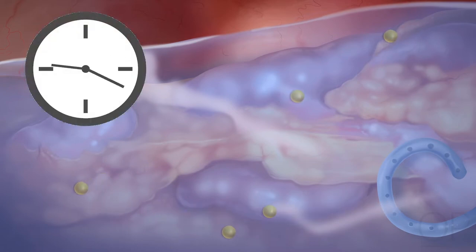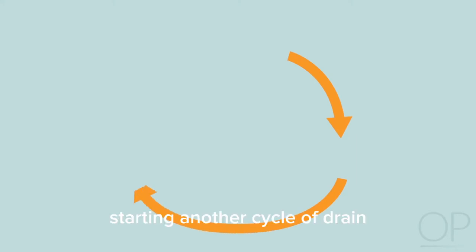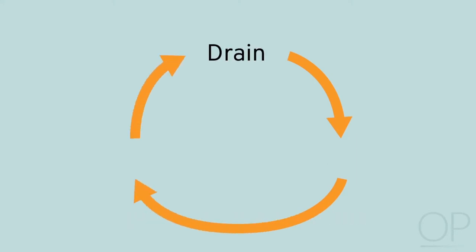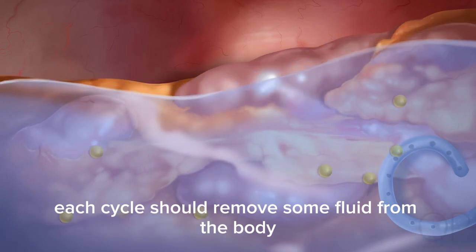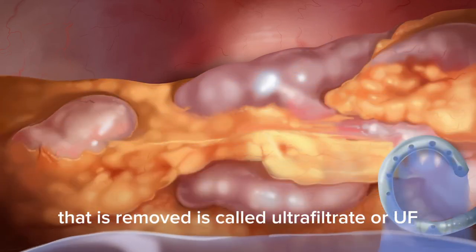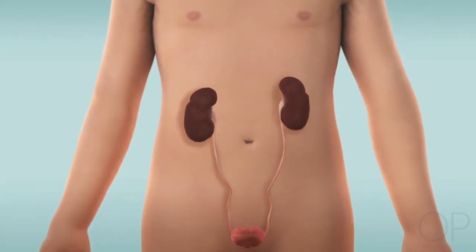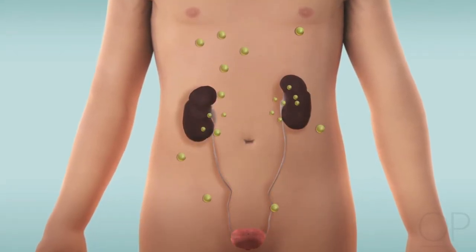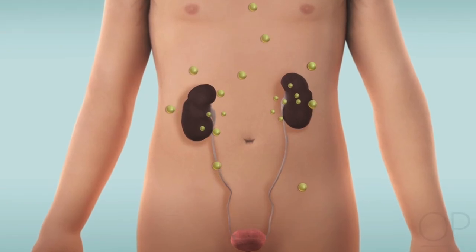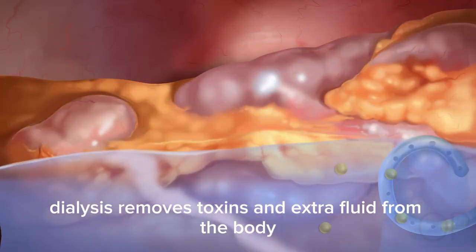The dwell time is how long the fluid sits in the abdomen. The steps repeat, starting another cycle of drain, fill, and dwell. Each cycle should remove some fluid from the body. The extra fluid that is removed is called ultrafiltrate, or UF. Let's review some concepts now. When the kidneys stop working, we need dialysis. Dialysis removes toxins and extra fluid from the body.